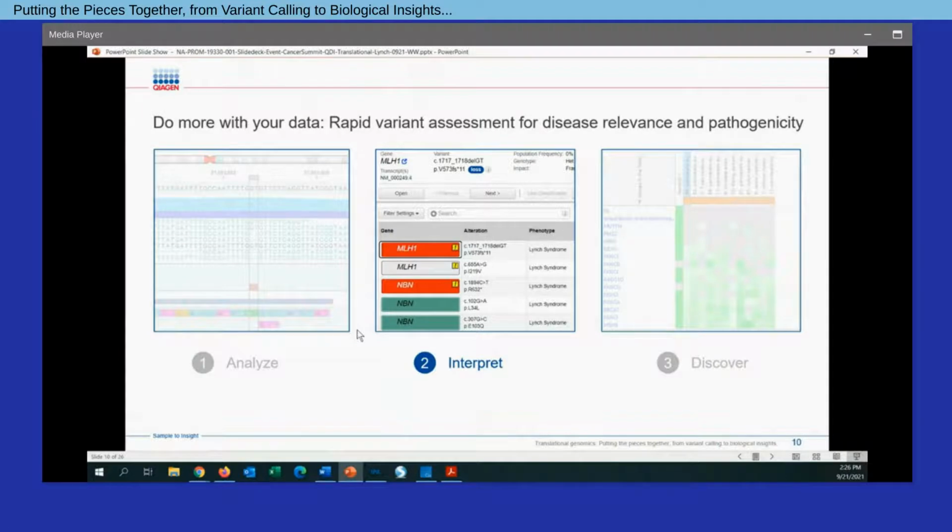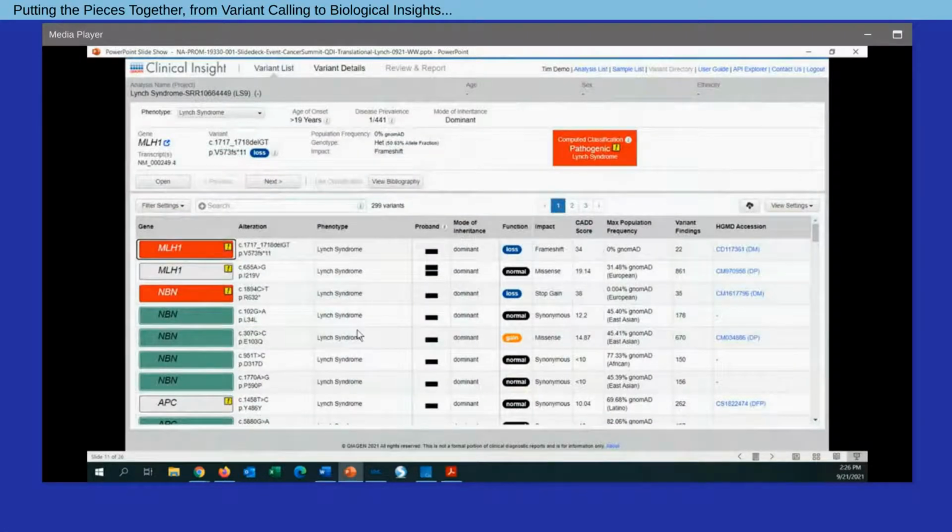Within the software itself, when we run, in this case, a particular sample from our cohort through Qiagen Clinical Insights Interpret Translational, what we are going to get back is a table of filtered and prioritized variants. In particular here, one useful feature within the software is that we can take all of the evidence that we find for a variant from the literature curation, from third-party databases, from different functional effect calculations, and actually utilize ACMG-based guidelines to compute a pathogenicity classification.